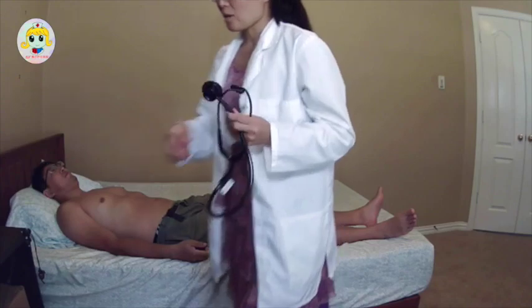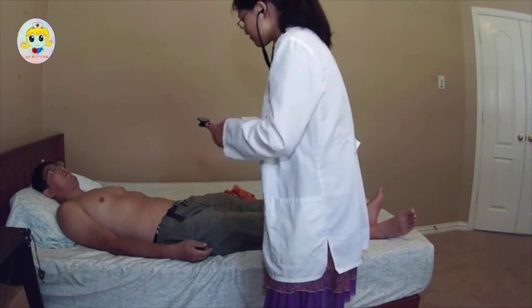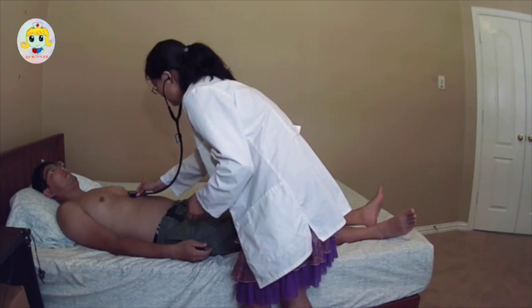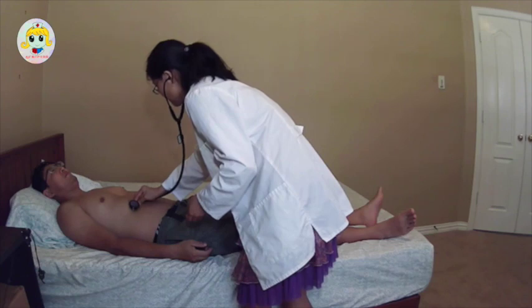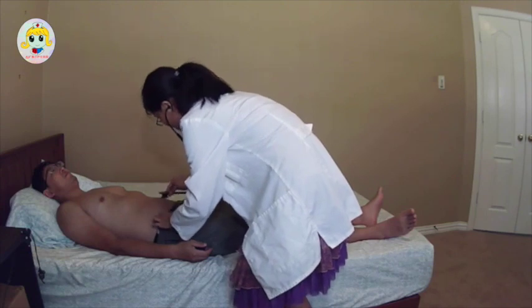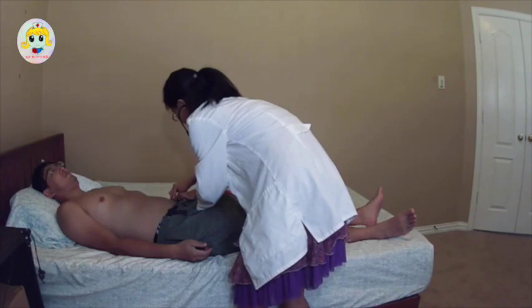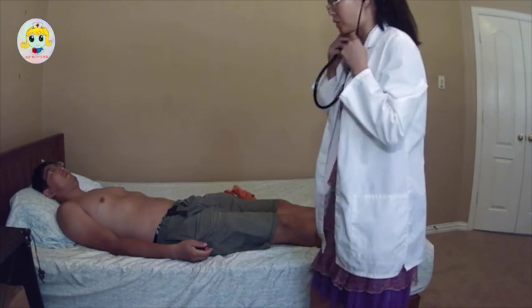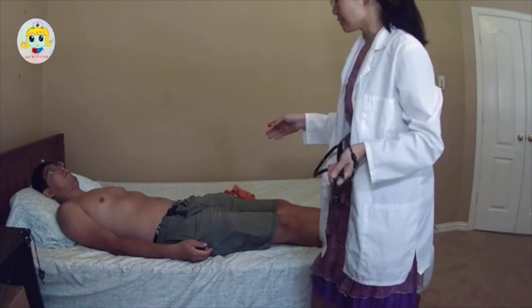Then I will listen to the arteries. I will use the bell of my stethoscope. Aorta artery, renal artery for both sides, iliac artery for both sides. If necessary, we'll also listen to the femoral artery. The arteries are normal. Next, I will percuss the abdomen.